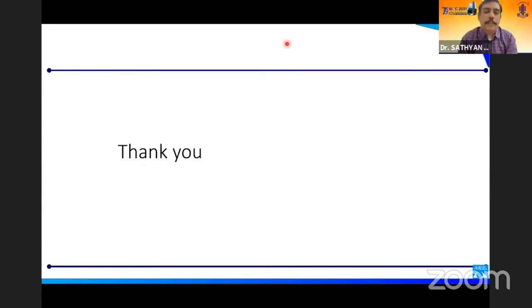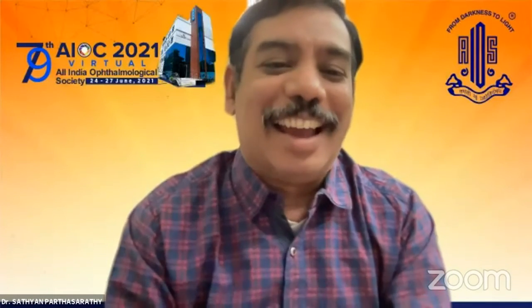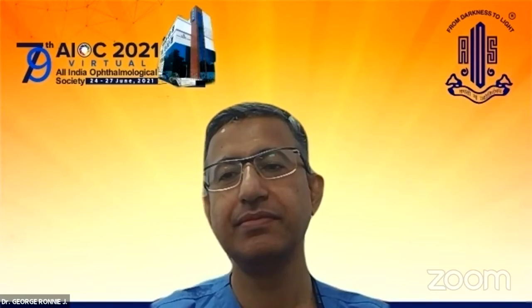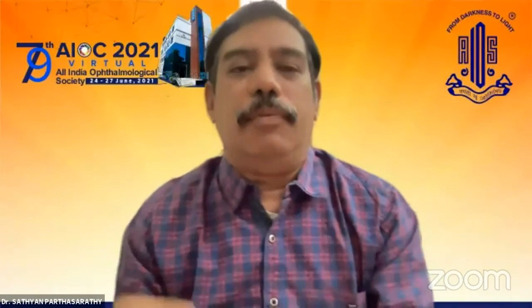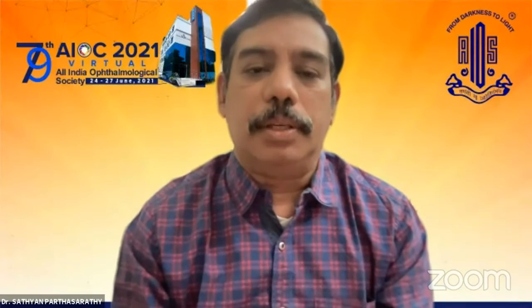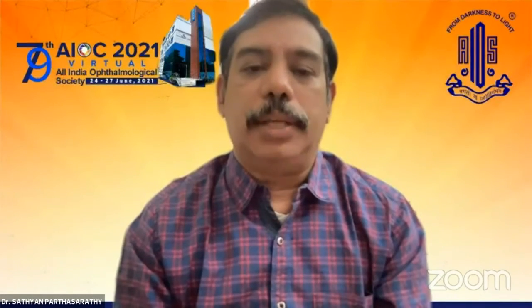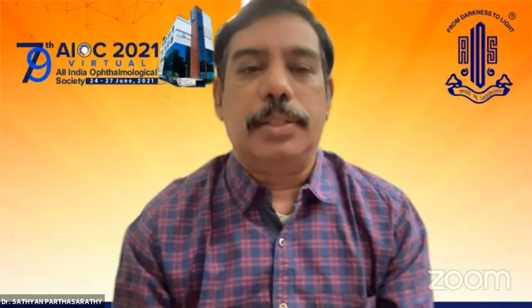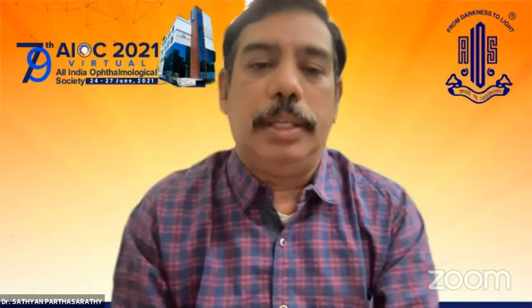Thank you. Yeah, thank you so much, Ronnie. Change is the only constant thing. We know that. And many of us do just look at the single visual fields and then come to a conclusion. We have two single printouts and say the patient is progressing or not. But it is not just enough. We need to understand the machine gives the software to understand which areas are progressing, which areas are not progressing. So please understand that we have to use all the other software to see the progression.